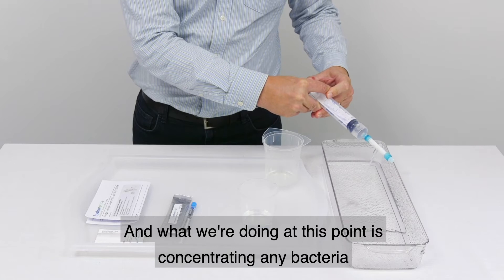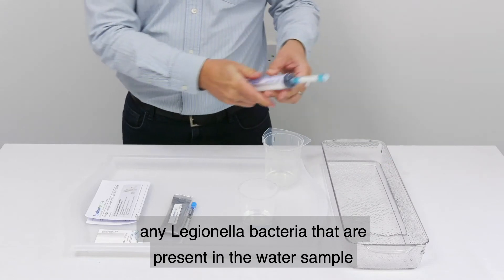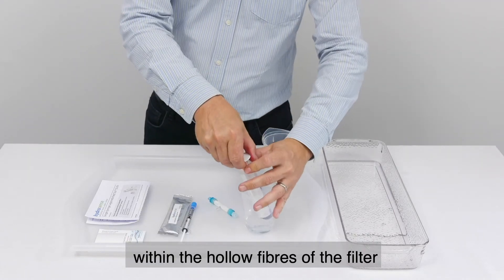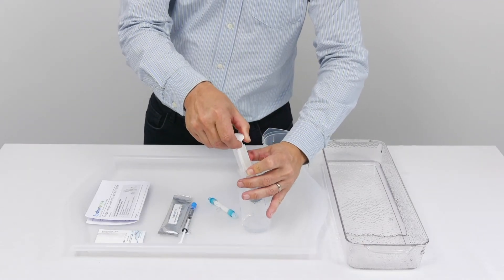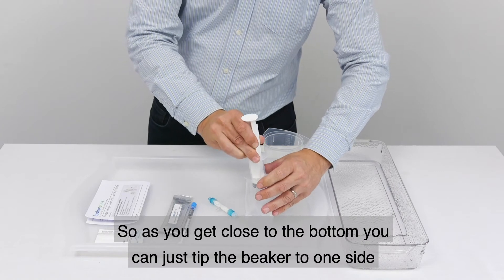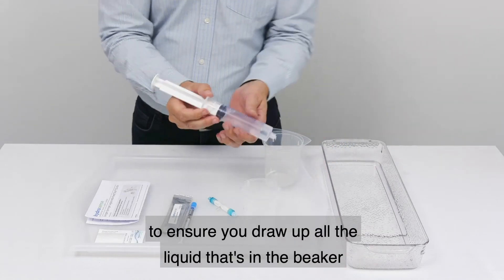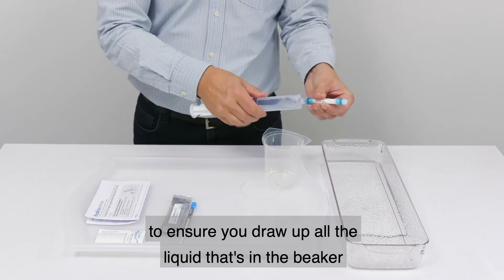What we're doing at this point is concentrating any Legionella bacteria that are present in the water sample within the hollow fibres of the filter. As you get close to the bottom you can just tip the beaker to one side to ensure you draw up all the liquid that's in the beaker.